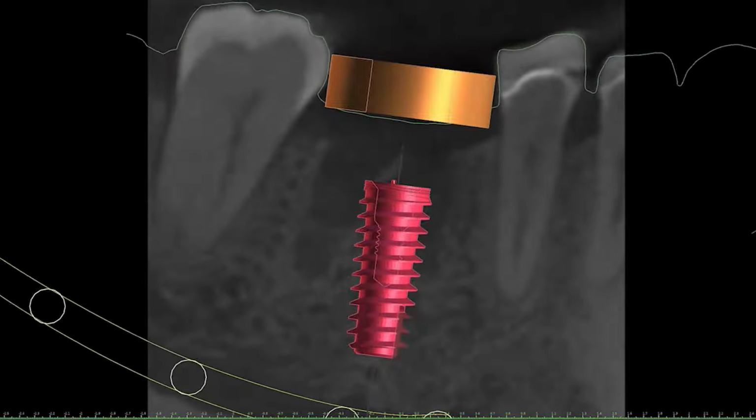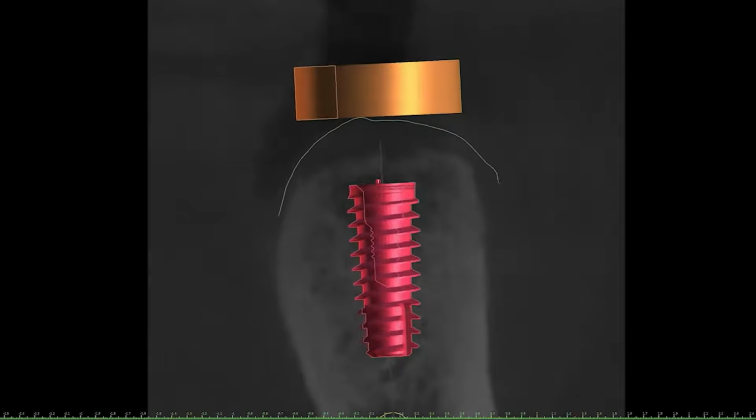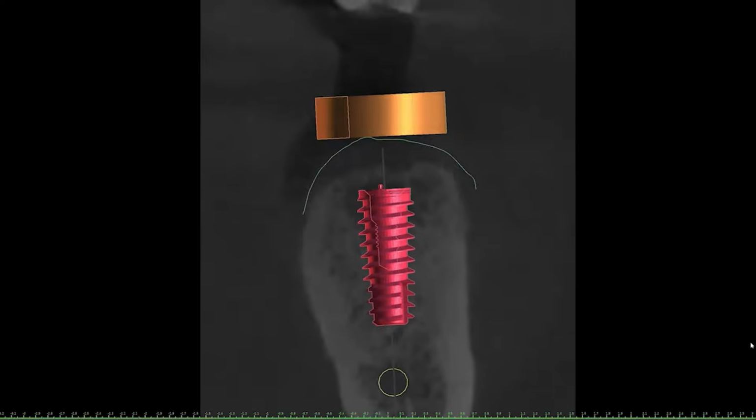So this is the proper position for the implant. It's right down the middle of the bone. Got good bone health on either side, good emergence for the future crown. So I'm thinking this has got to be the right spot, right? This is good positioning, going to be a great future tooth for her, and she'll be able to chew the rest of her life with that. Should be very healthy. Now it's time to create our implant guide.